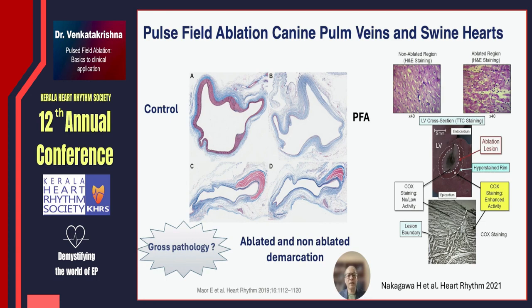The pulse field ablation in this particular slide depicts the histological effects in the canine tissue, and here it is the swine ventricle.